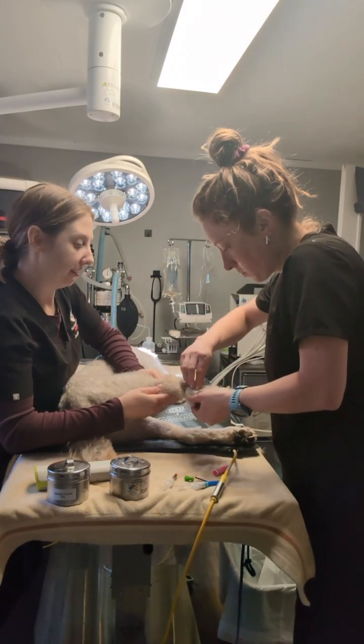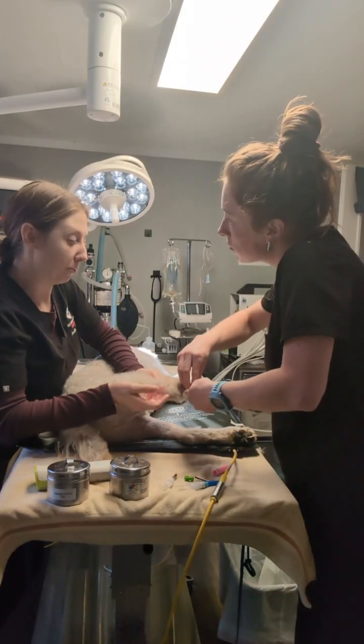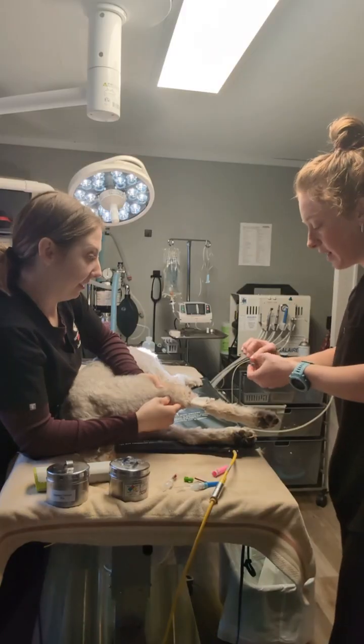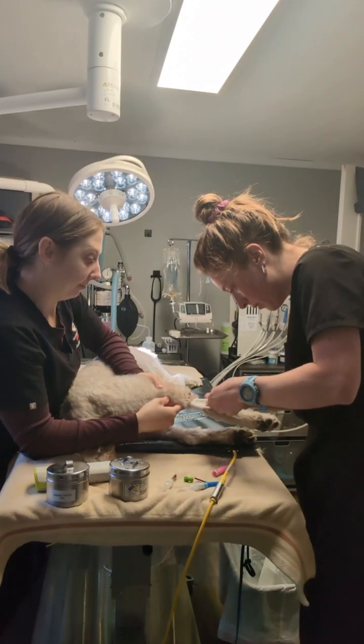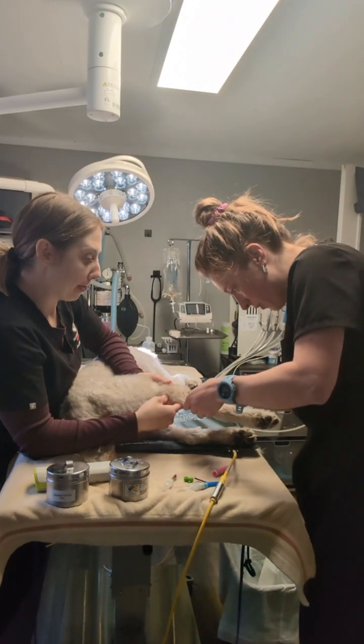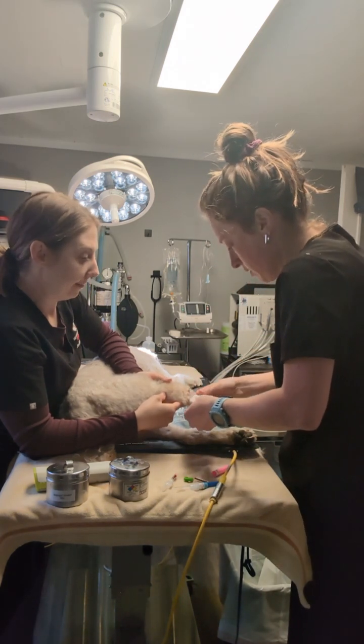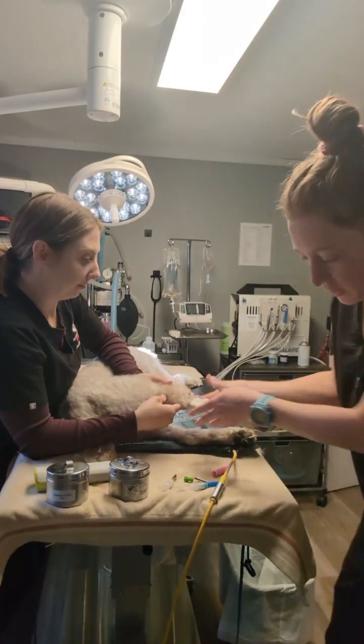Backward catheters, I like to put vet wrap just because it's more likely to get pulled out when you're moving them. Okay, so just for, yes, I did the extra last video, wrap the catheter, so that'll be perfect. And you like cut a hole in it, right? Yeah. Perfect.